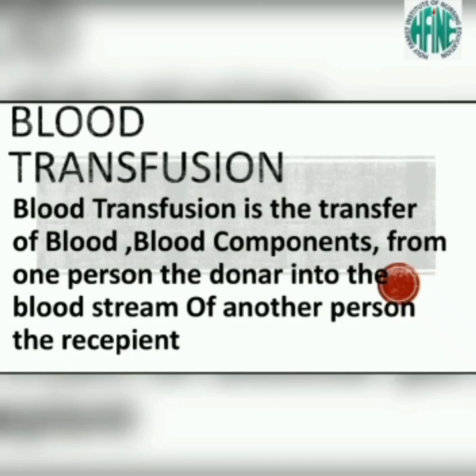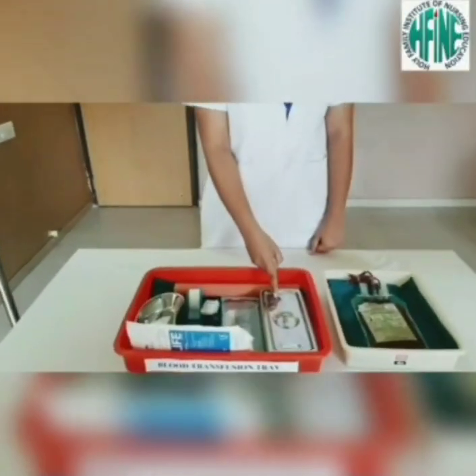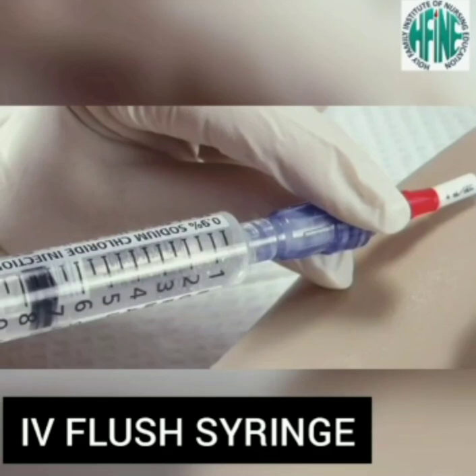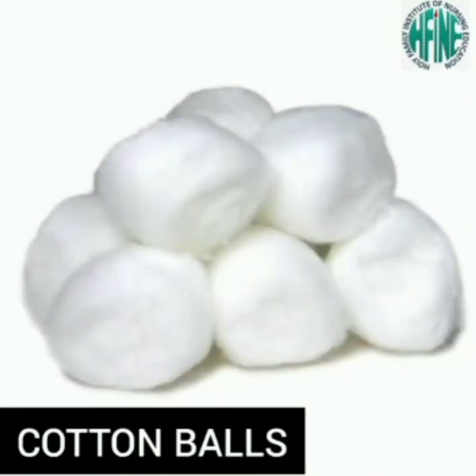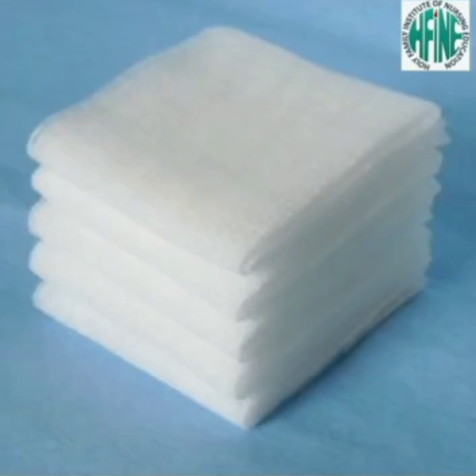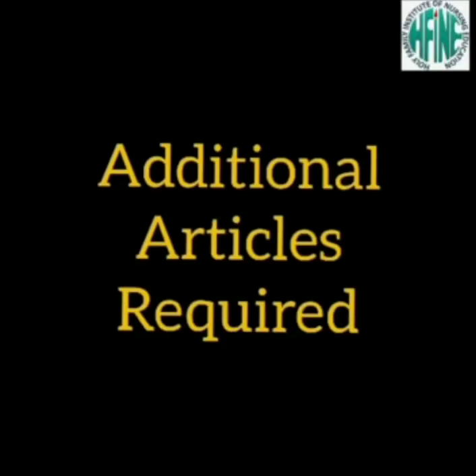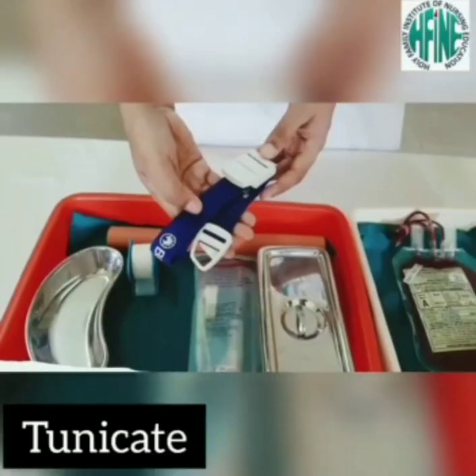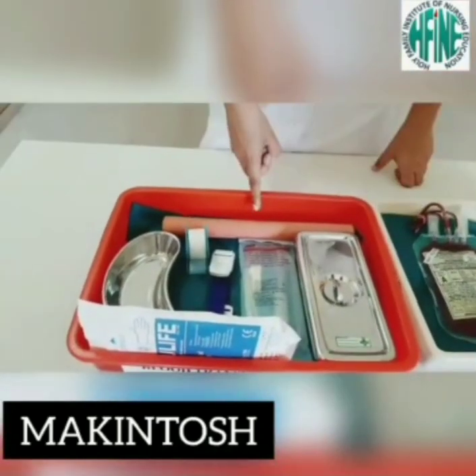Required articles include a sterile tray containing IV cannula, anti-allergy drugs, IV flush syringe, cotton balls, and gauze piece. Additional articles include sterile gloves, blood transfusion set, blood bag, tourniquet, Macintosh, kidney tray, and IV stand.